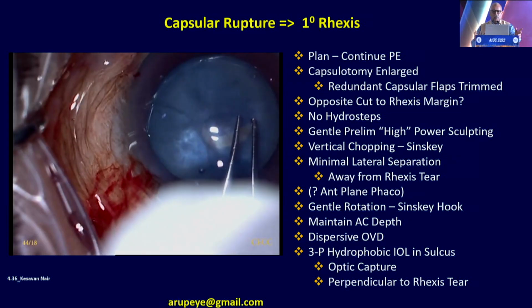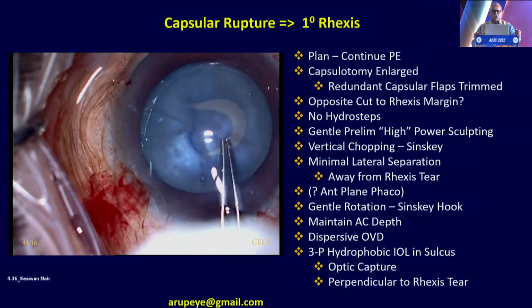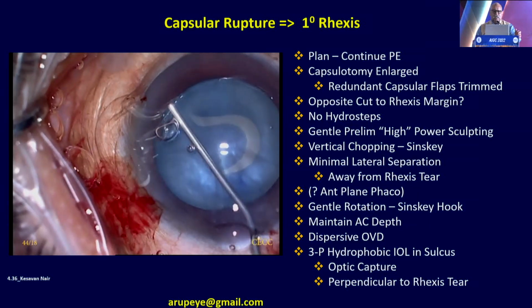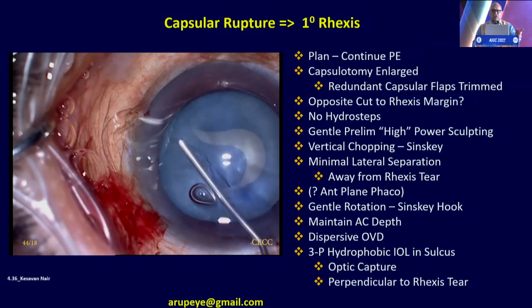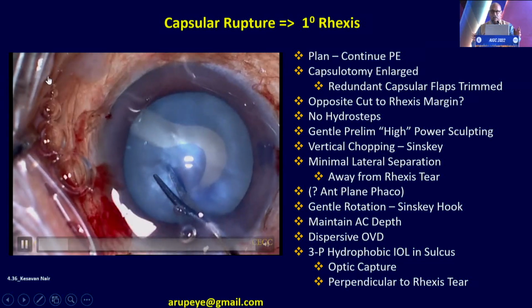So I switch the instruments. I take a Utrata forceps, and at that moment, the tear goes very jerkily, and it again has an angle going to the periphery. So I use Healon 5 in this situation, injected not at the center, but in the periphery.